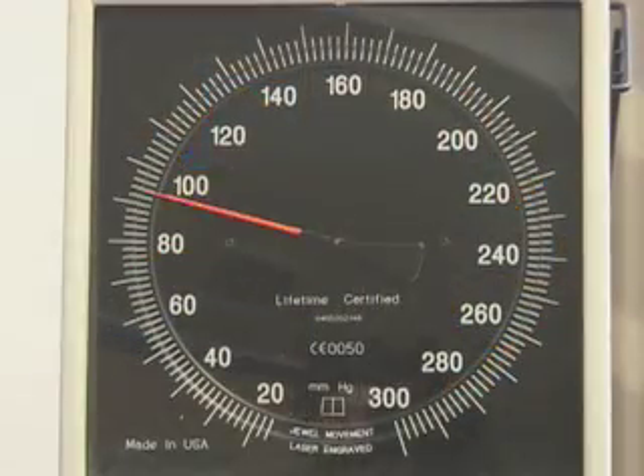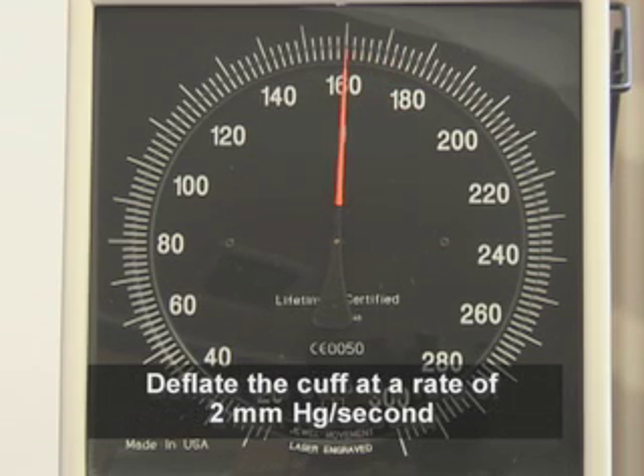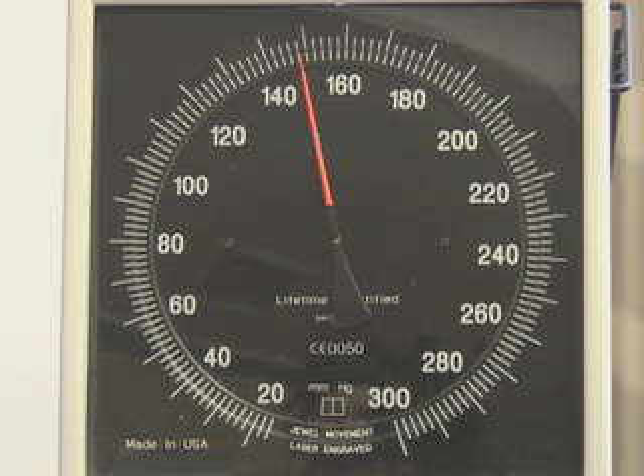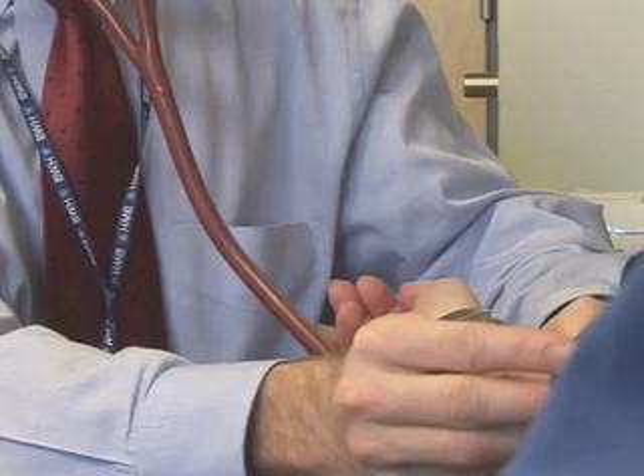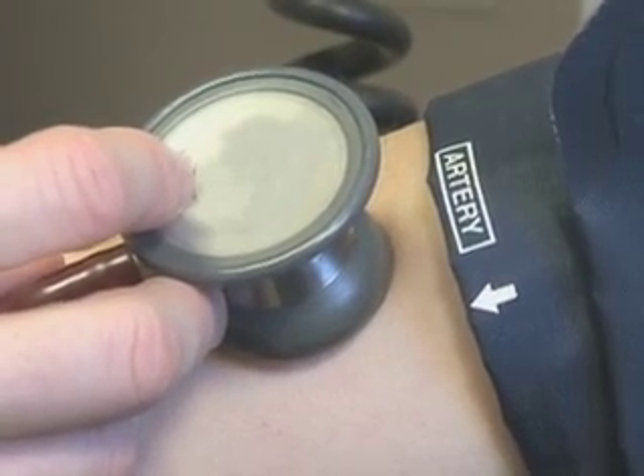Inflate the cuff to a level 20 to 30 millimeters of mercury above the pulse obliteration pressure. Then deflate the cuff at a rate of approximately 2 millimeters of mercury per second while listening for sounds. As the pressure in the cuff is decreased, blood flow in the brachial artery increases, creating turbulence, which generates Korotkoff sounds.